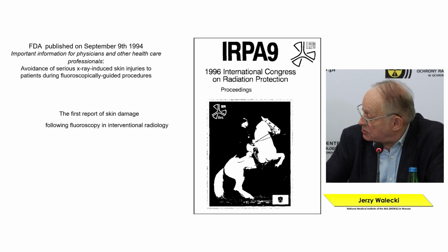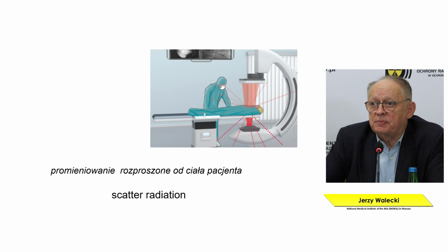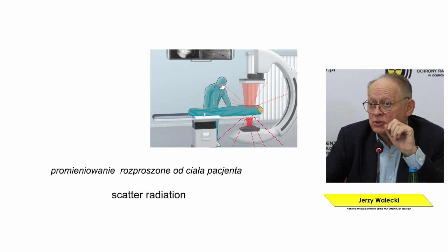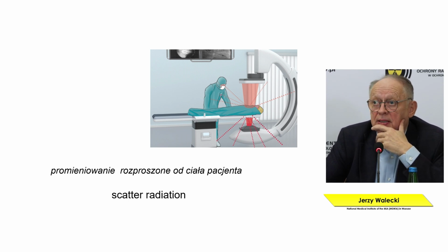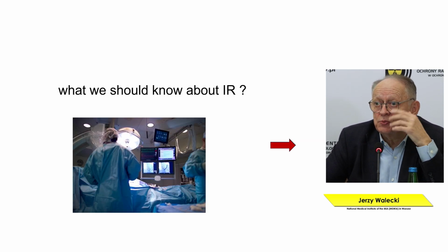This induced changes not only refer to skin, although the skin injuries are the best tested. The director mentioned scattered radiation, that is radiation scattered from the patient. Well, the patient is the main source of radiation to the staff. So we must remember about scattered radiation.